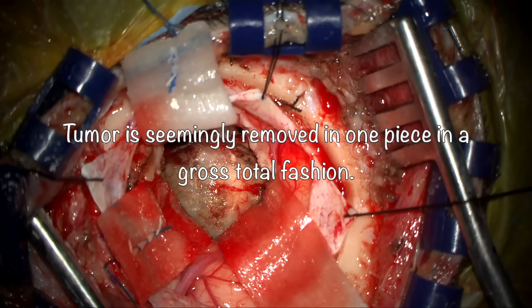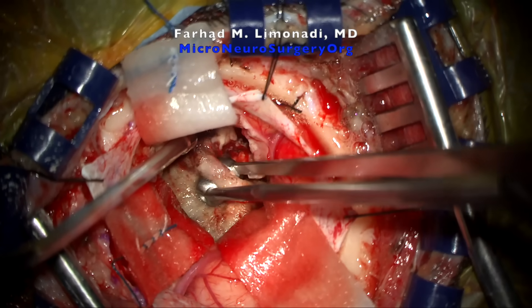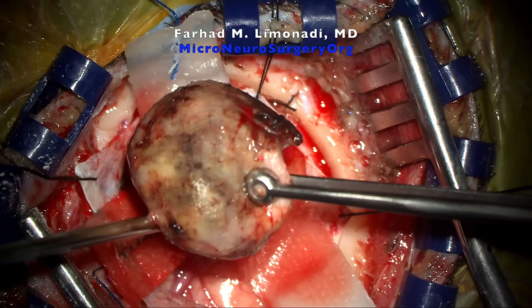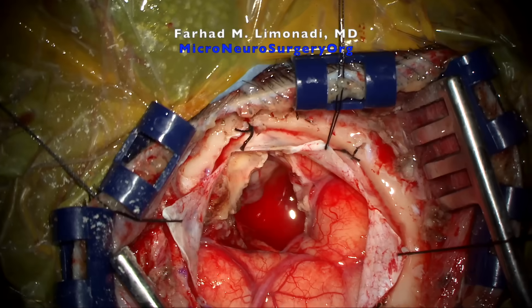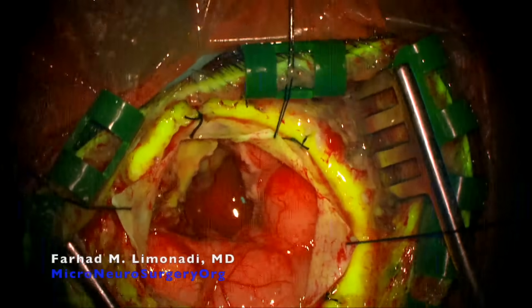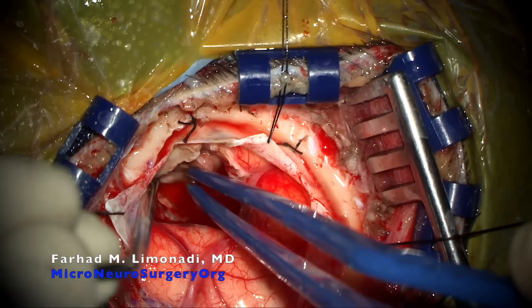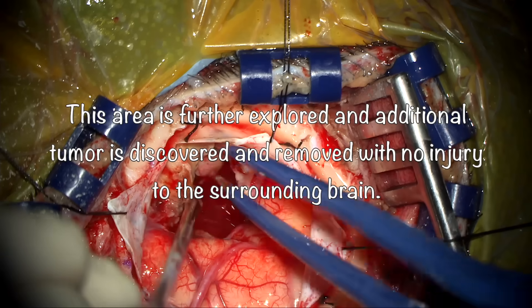The tumor is seemingly removed in one piece in a gross total fashion. However, we are well aware of our blind spot in the inferior border of the exposure and pole of the tumor. Sodium fluorescein-guided microscopy showed an area in the blind corner suspicious for residual tumor. This area was further explored and additional tumor was discovered and removed with no injury to the surrounding brain.